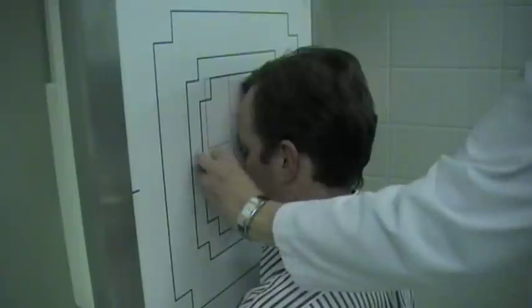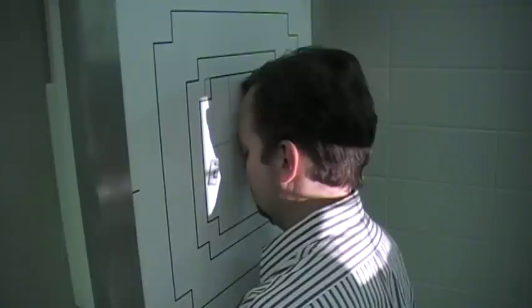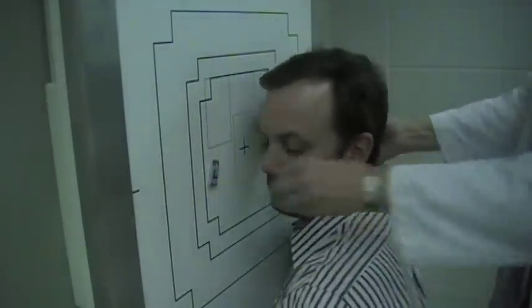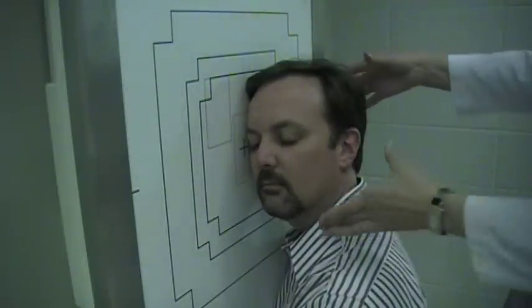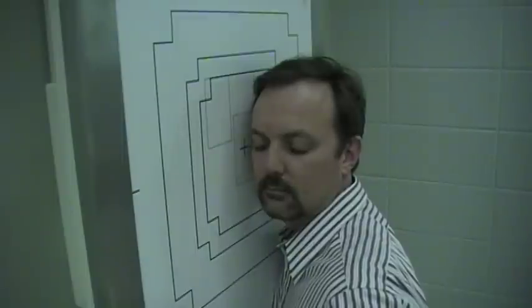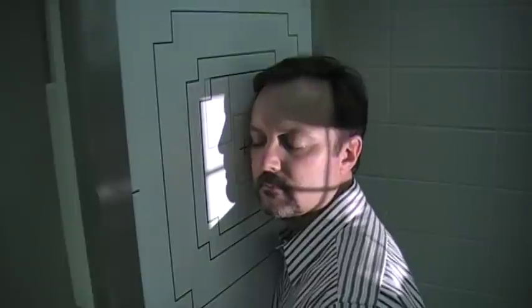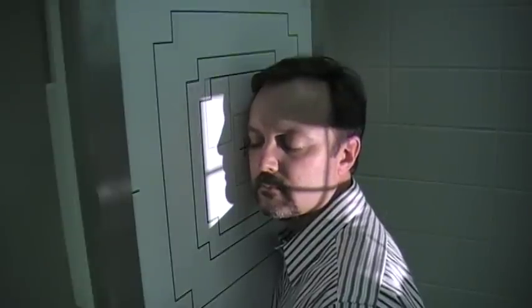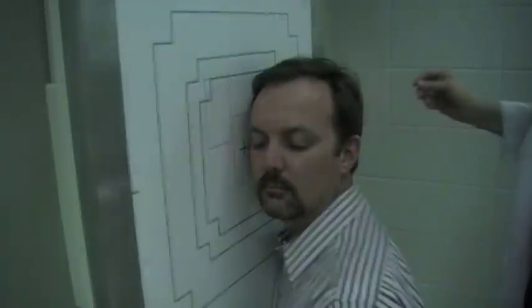Okay, and then put your left marker up here, because that is the left side of the mandible that we're going for. Then on our next projection, we're going to do the axiolateral oblique. And I'm going to ask David to turn his head to the right. You want to do both sides, the right and the left side. Get the head in a lateral position as if you are doing a skull x-ray. Now this does use the same angle as our previous angle. I'm using a 25 degree angle, and have the head lateral. We are imaging for the rami.